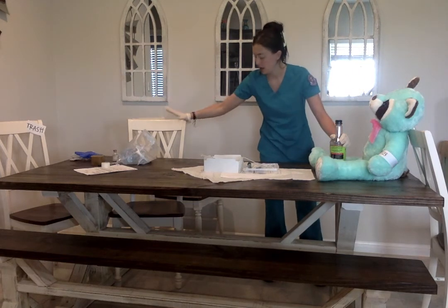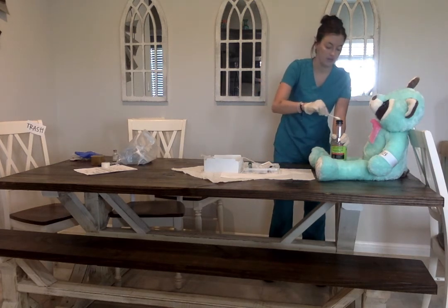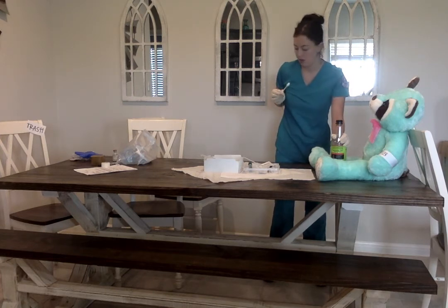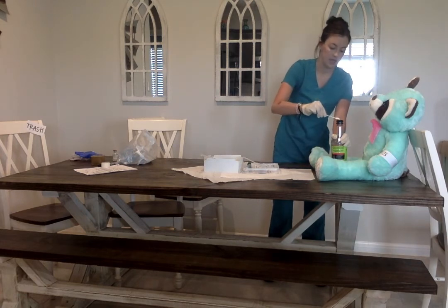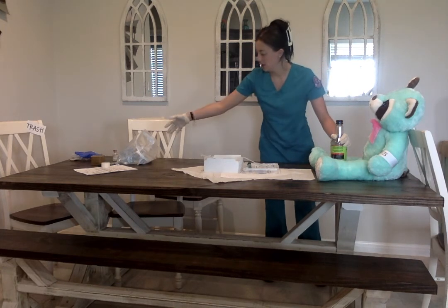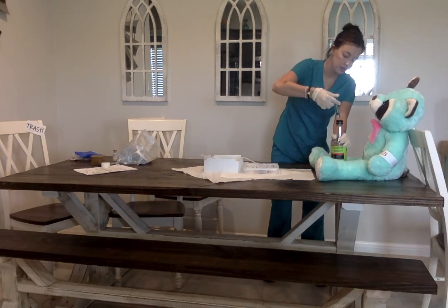Swab, trash. Gonna repeat that 2 more times. From the top all the way to the bottom. Swab, trash. And 1 more time. From the top all the way to the bottom. Swab, trash. Still holding. I'm going to inject 5 mLs of lube in here.